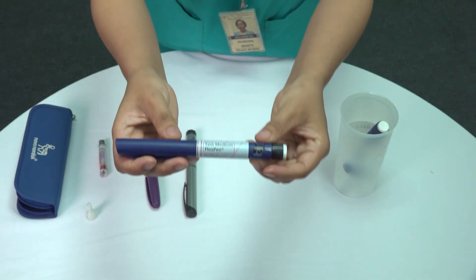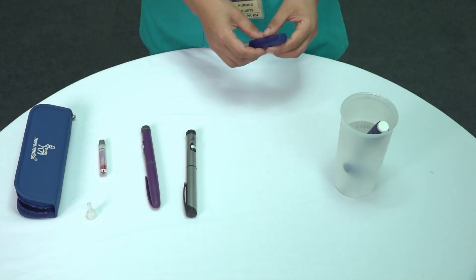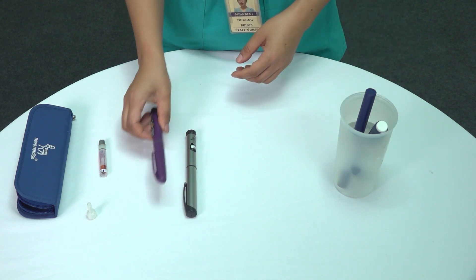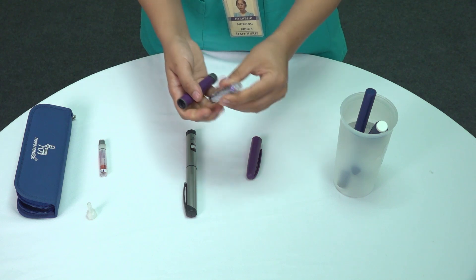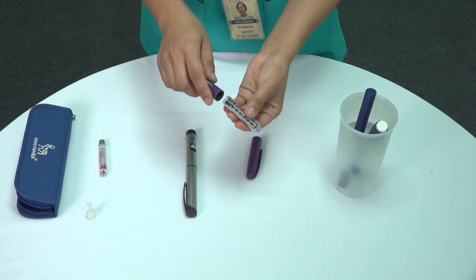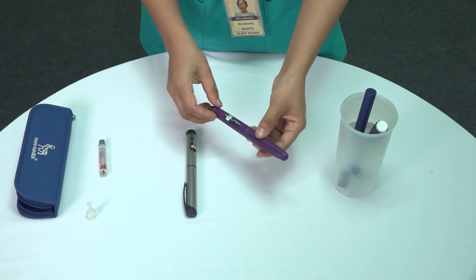Next, we have permanent pens. These pens allow patients to replace the insulin cartridge, so they don't need to buy a whole new pen each time. Once the insulin runs out, only the cartridge is replaced, not the pen.